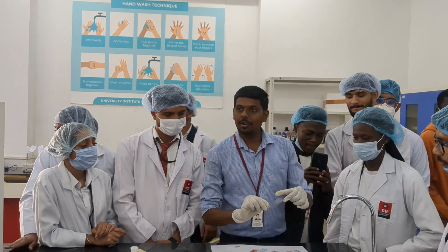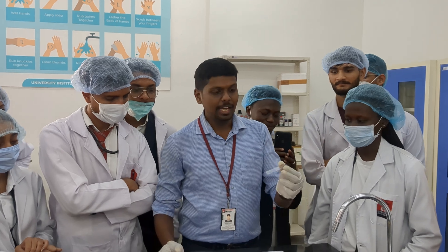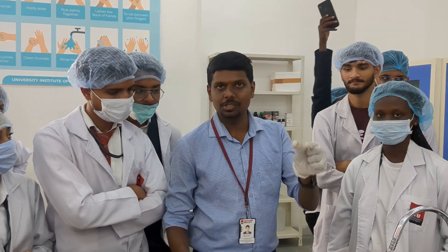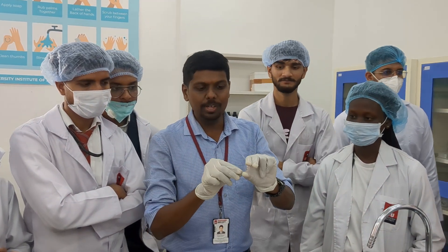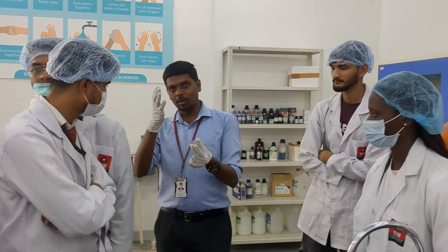We have performed the smear, stained it with Leishman stain, and waited for air drying. It is already dry. Now we will observe this under the microscope.